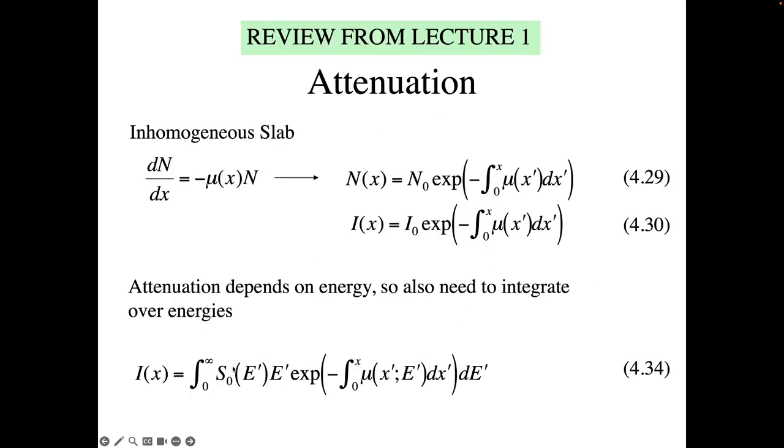With the slide before this was this re-explanation of the attenuation of x-rays as a function of distance through a material, such that the intensity that you measure at your detector is proportional to the intensity from the source multiplied by the amount of diminution of signal through absorption, right? And it was a number between 0 and 1, and this is that number.